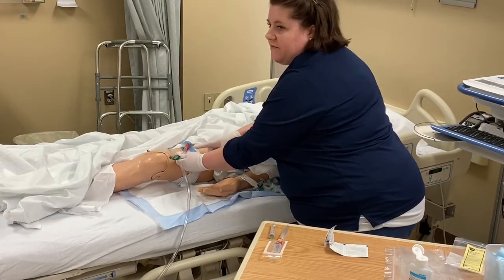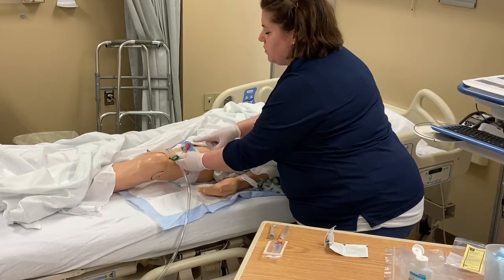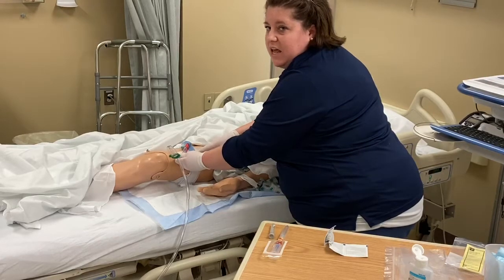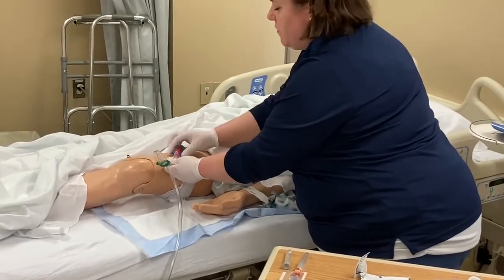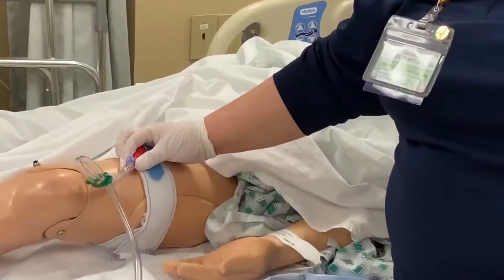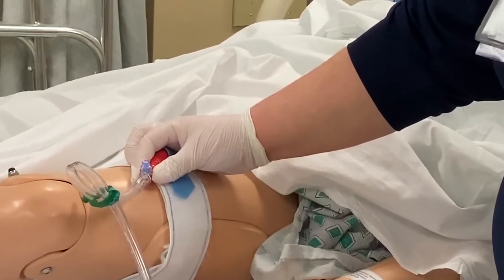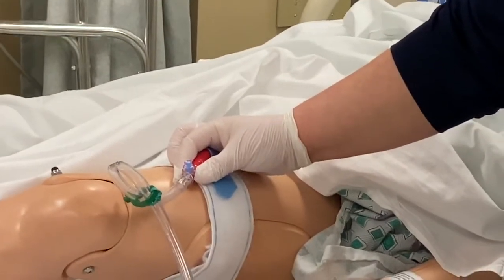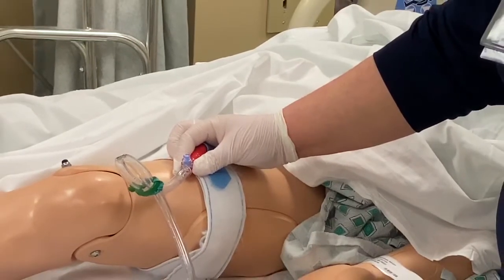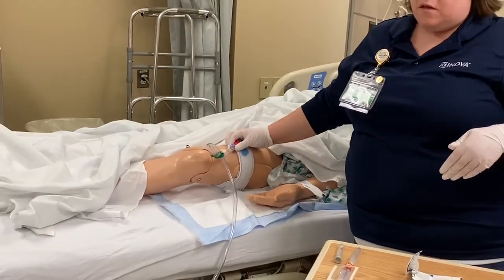And now, since I've cleaned, I want to make sure that I don't let this port go, because if it drops and touches the skin, it will be contaminated, okay? The reason that I clean this port is because any bacteria that might be on the port potentially could get into my sample and give a false reading, and then the patient might get the wrong antibiotic. So I want to make sure we're only seeing any bacteria that's actually in the urine, okay?